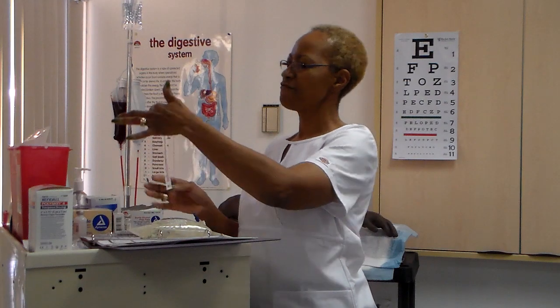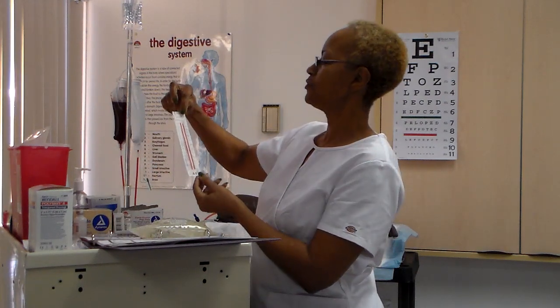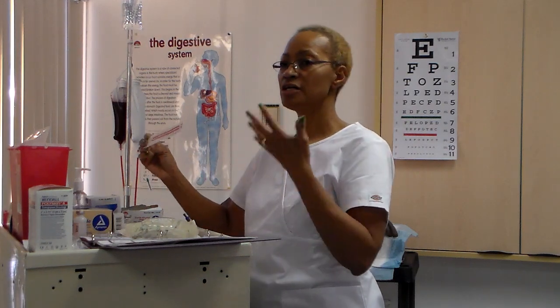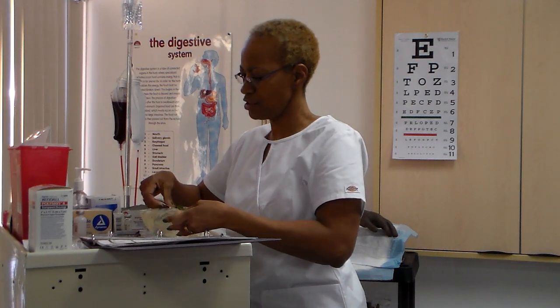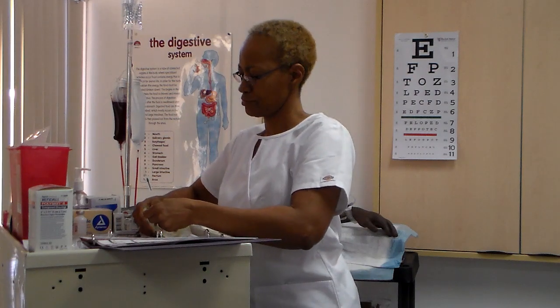Now, this is a 500 milliliter label for a 500 milliliter bag. And then if you had a liter bag, you would have a liter label. So make sure that you obtain the correct one. You're going to line up your 100 milliliter with your one on the side of your bag.